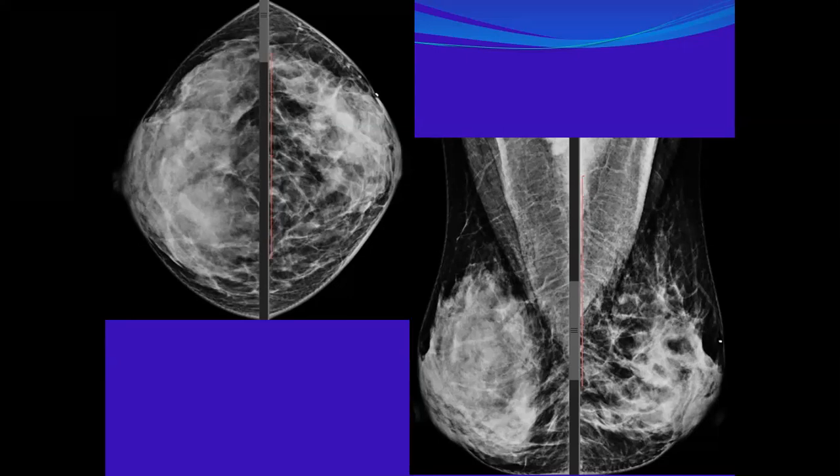If it is not available, you have no previous, and you have not got the patient to ask about, you did not find a history. Okay. So I will make it BIRADS 0. I have to recall the patient. Yes. And I cannot diagnose global asymmetry without it, so I have to call for further assessment.